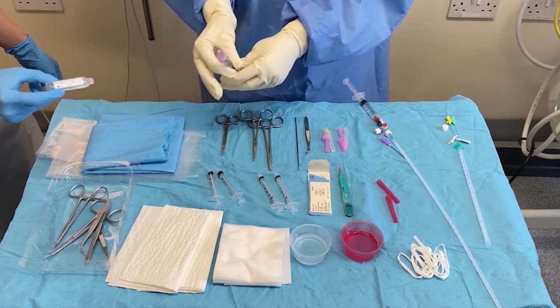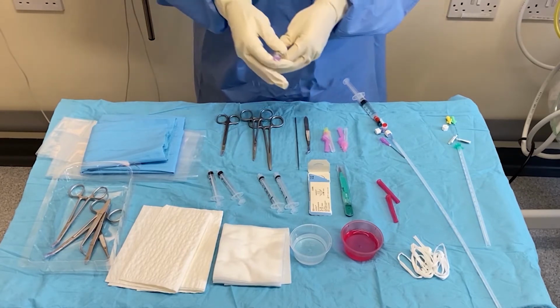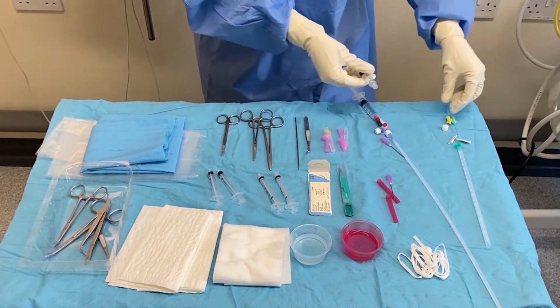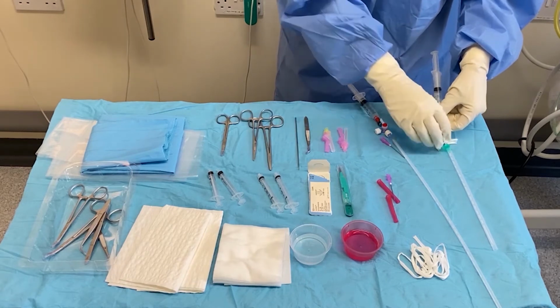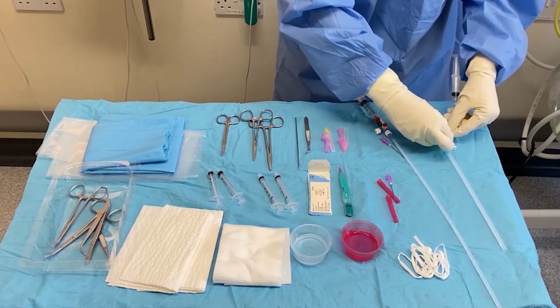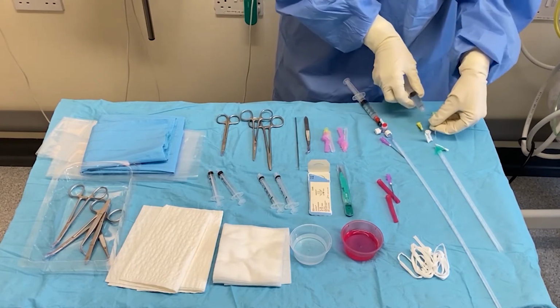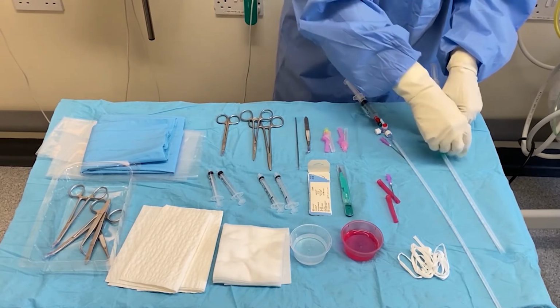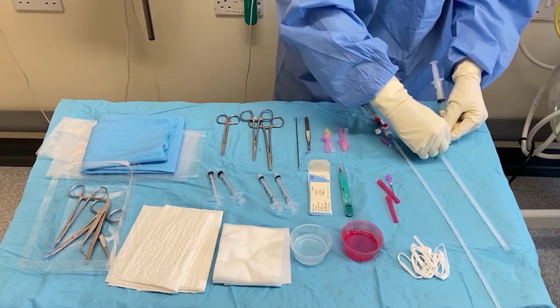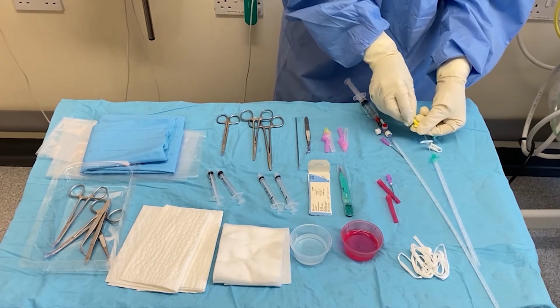So again, we're drawing up the saline, getting rid of the air. You need to flush both of the lines, clamping off as you go. And the line that you're not using with the syringe, then you obviously need to put bung on that.